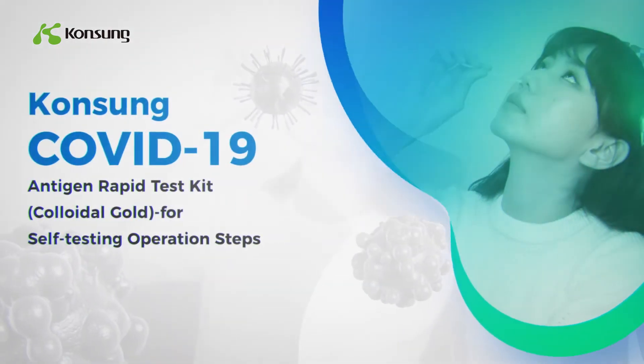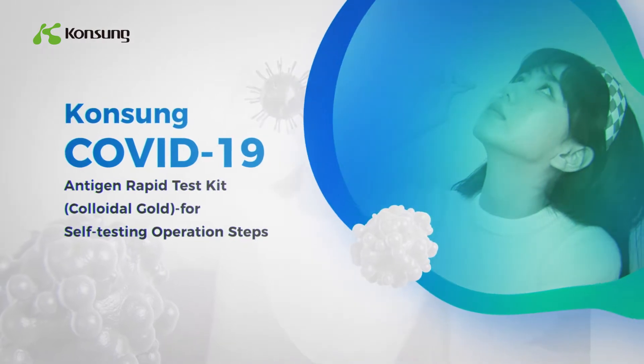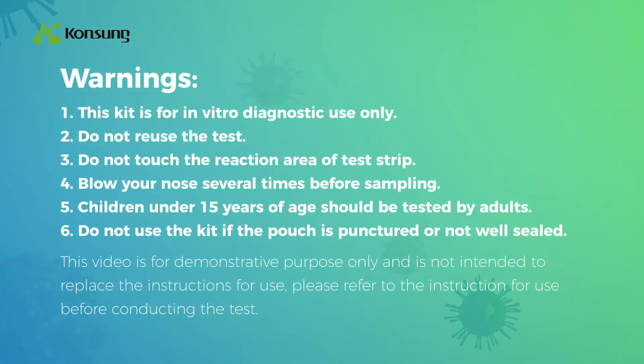Konsung COVID-19 Antigen Rapid Test Kit Colloidal Gold for self-testing operation steps. Warning 1: This kit is for in vitro diagnostic use only.